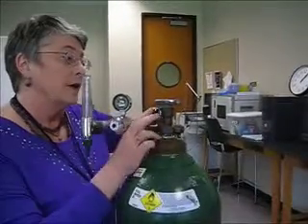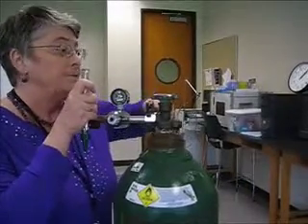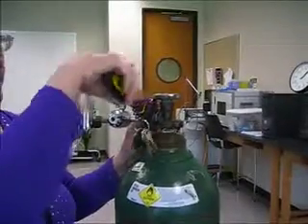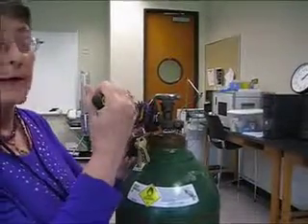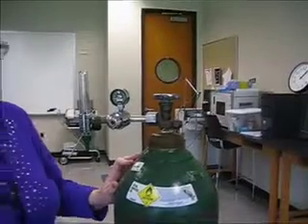And I'm going to tighten it. Now we try to keep this straight while we're tightening. Sometimes if your hands aren't strong, like a lot of us women don't have strong hands, I will tighten it by dropping my knees and using the weight of my hips to tighten it. Men generally don't have a problem, but sometimes women, we have a little bit of a problem.